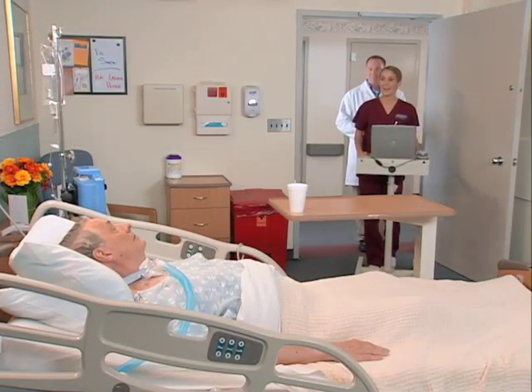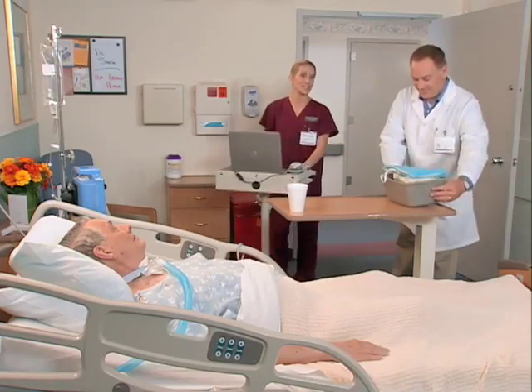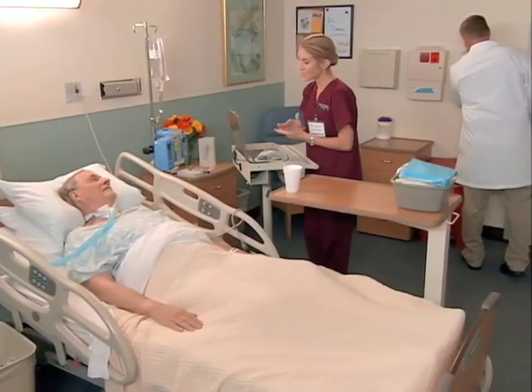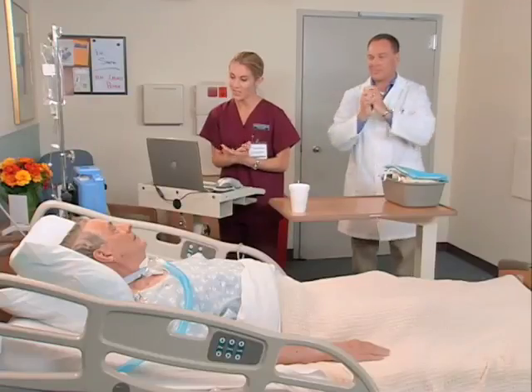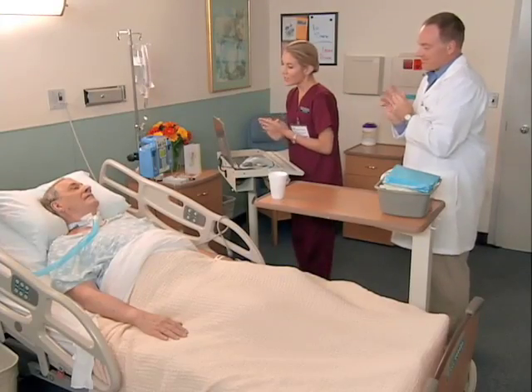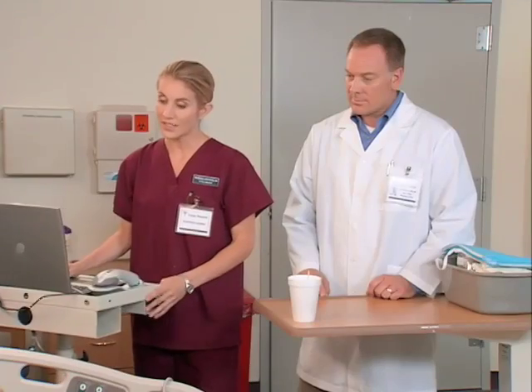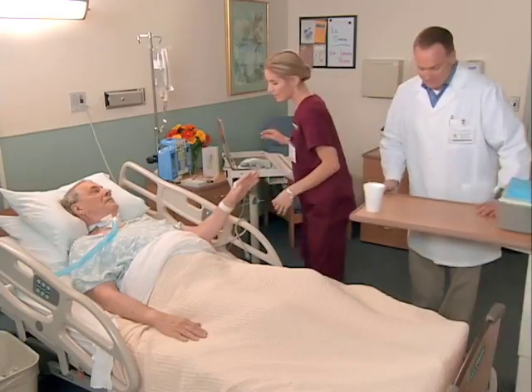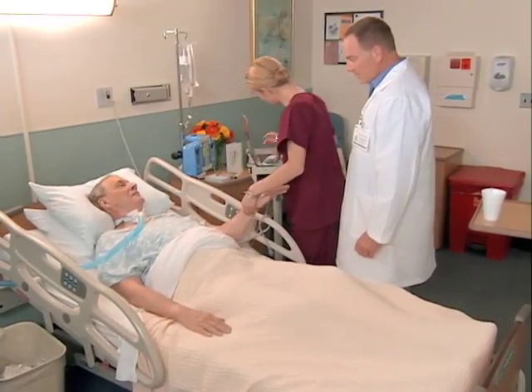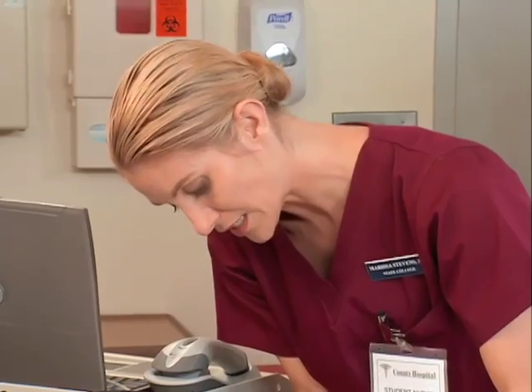Mr. Marks? Hi, it's me again, Marissa. And this is Mr. McDaniel, my nursing instructor. Hello. Since your tracheostomy is keeping you from speaking right now, you can just nod yes or no to respond to my questions. Does that sound okay? Okay, great. We're going to perform your tracheostomy care, okay? Thanks, Mr. Marks. Can I see your ID, ma'am? Thanks. Harry A. Marks? Great, and your birthday is January 21st, 1944.